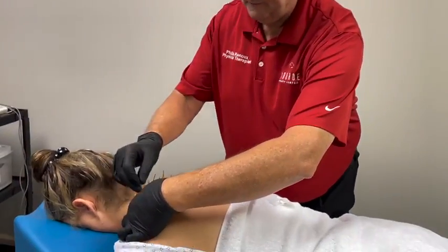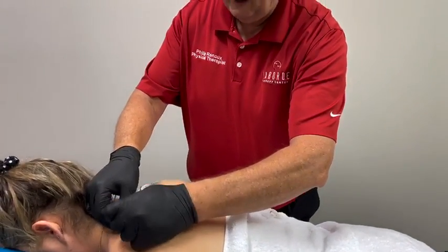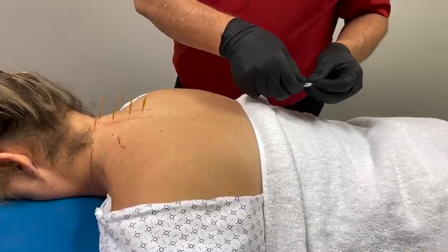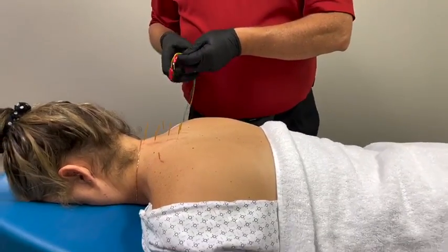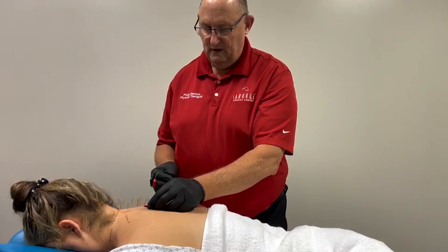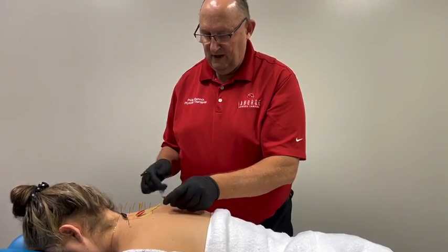And what that does, it makes micro trauma in the actual muscle fiber or the myofascial tissue of the muscle. And this makes your brain release opioids to heal that micro trauma done to the myofascial tissue where the needle was inserted. So that little micro trauma caused by the needle will allow your body to start to heal by getting the opioids down to where the muscle is injured. And then while the opioids are down there, it kind of notices, oh, there's some other stuff that we thought was normal, which is causing pain, and it kind of jump starts your body to start to heal. So it's a very good technique, or tool, that a therapist might use.